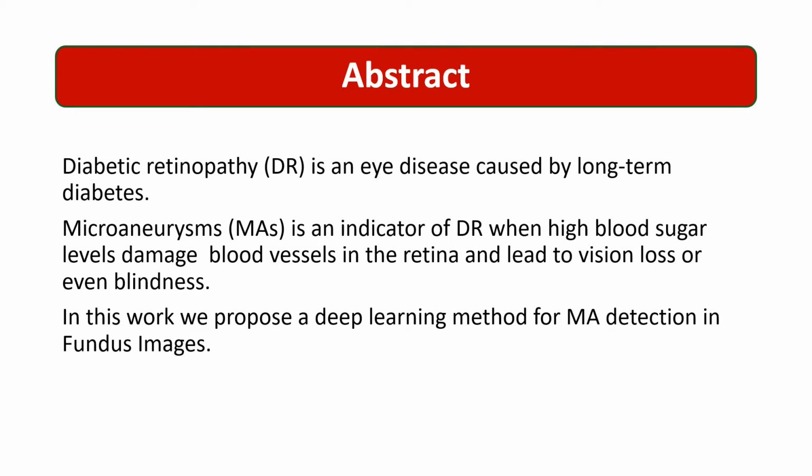As we know, diabetic retinopathy is an eye disease caused by long-term diabetes, and microaneurysm, or MAs, is an indicator of DR when high blood sugar level damages the blood vessels in the retina and leads to vision loss or even blindness. Since DR is a progressive eye disease, the early detection and diagnosis of DR is important to prevent patients from blindness. In this work, we propose a deep learning method for this microaneurysm detection in fundus images.